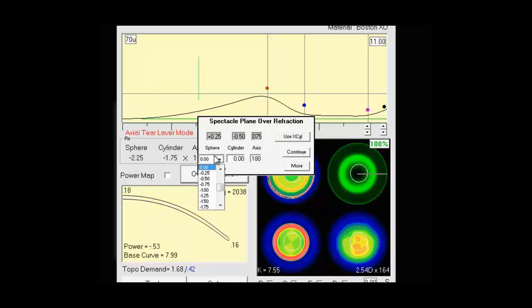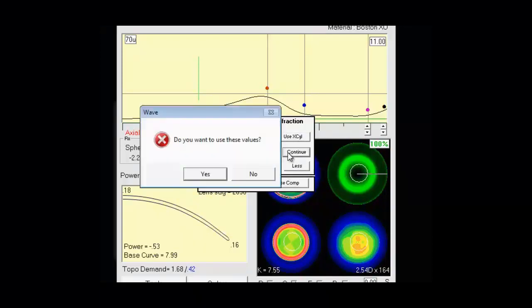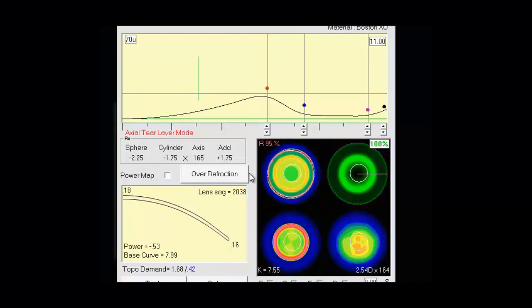If you have an overrefraction to enter you'll do it here. If you want to add prism there's a checkbox to add prism. And if you have subsequent overrefraction you'd enter it in the more box and hit use comp and it enters that up there. I'm going to say no at this point to not use those values as this is just a screen walkthrough.